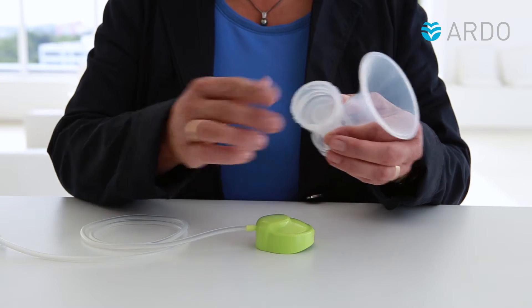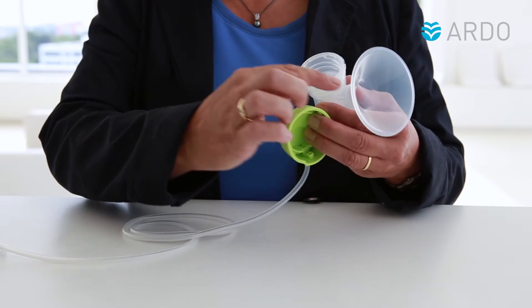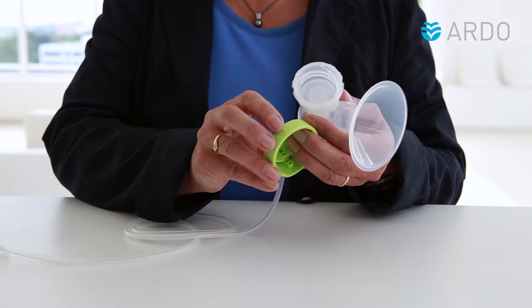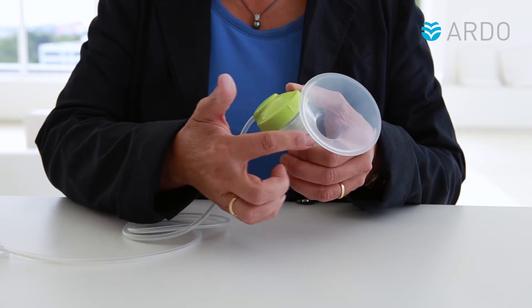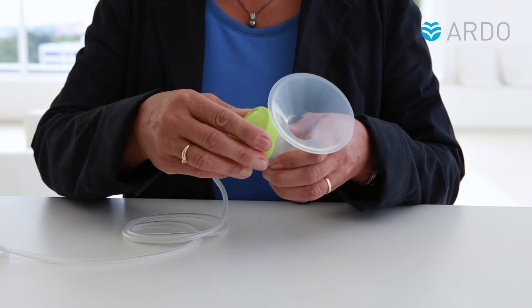When attaching the green lid, position the line markings on the cap and the breast shell so that they line up. Then gently turn the cap approximately half a centimetre to the right.